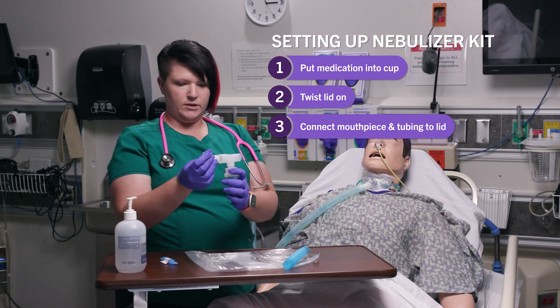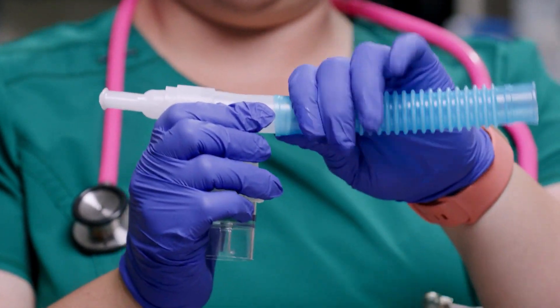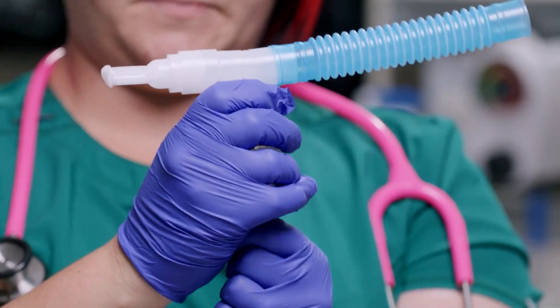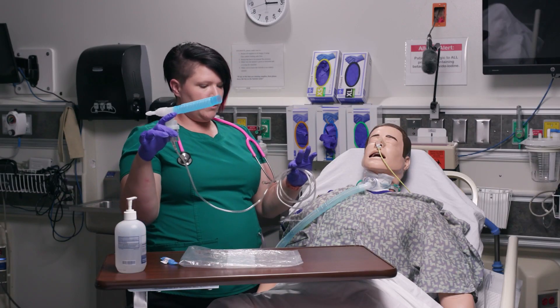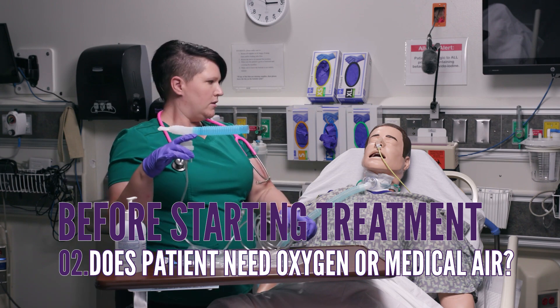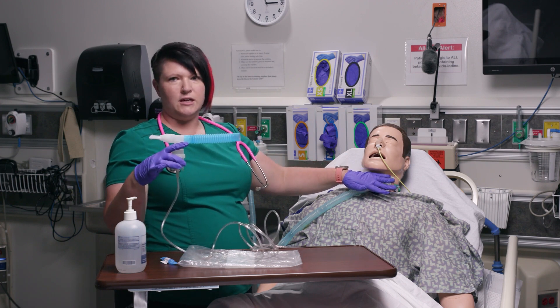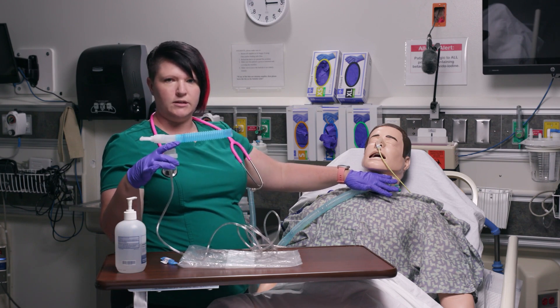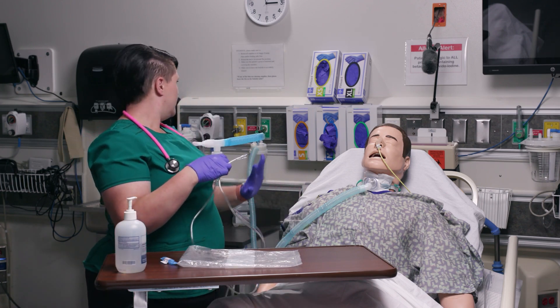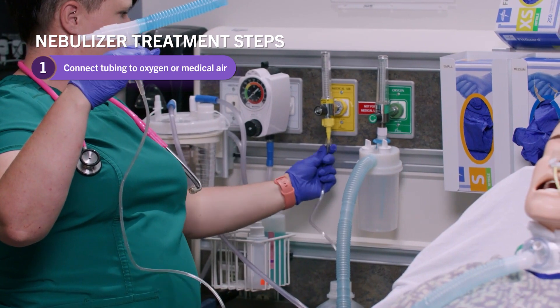I'm going to place the T-piece on. I'll place the mouthpiece in the larger end and attach the corrugated tubing on the opposite end. Now I have oxygen tubing — I'll stick that on the bottom. Equipment is ready. My patient has no nasal cannula, indicating he is not on oxygen — I would also check the chart to confirm. So I'm going to use medical air, which is the yellow outlet here, and connect my tubing to it.